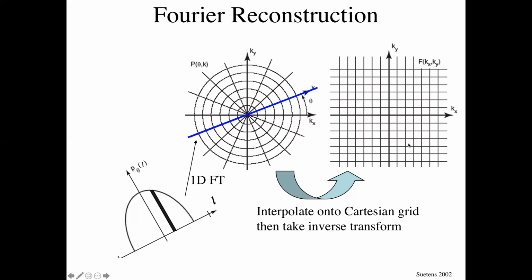And an interesting thing occurs: if I'm close to the origin, so I want to interpolate a point right here, I have a very high density of measurements, because I've got all these data points along here. However, out at the periphery, I may not even have a point very close. It's out here, and so I'm a fairly good distance from any actual measured point. So it's this variable density that is the key to how to do this reconstruction correctly.